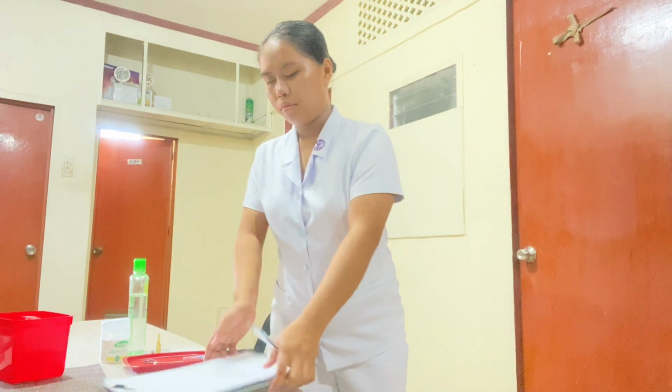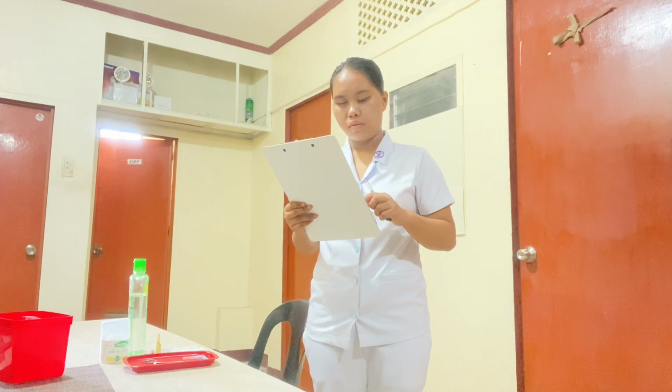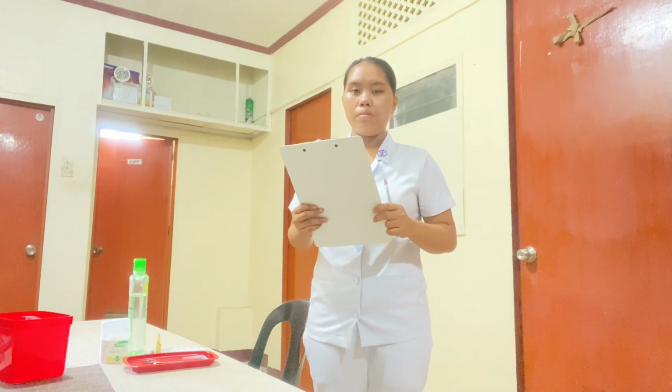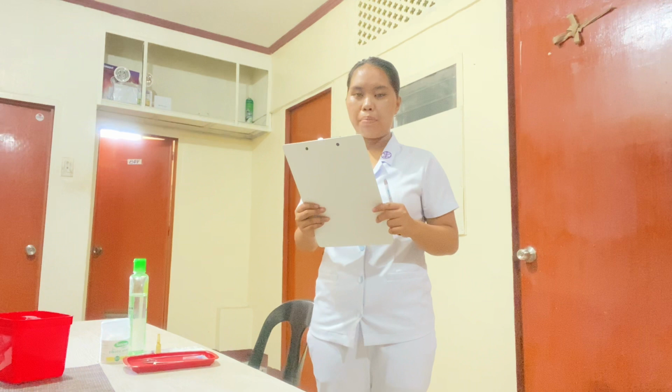Check the MAR, or the medication administration record. This is a legal record of the drug administered to the patient. Check the medication against the MAR to make sure that the correct medication is being prepared.